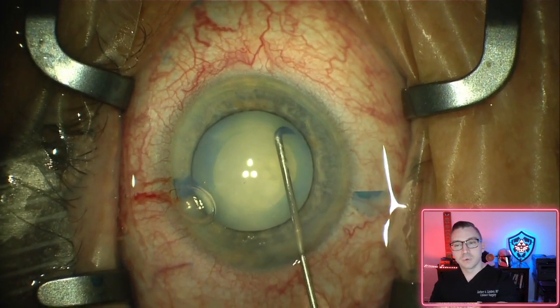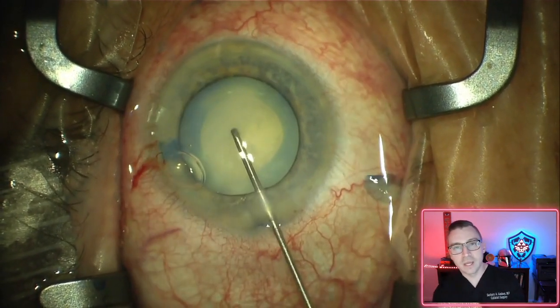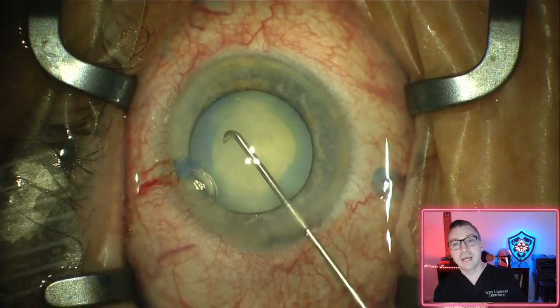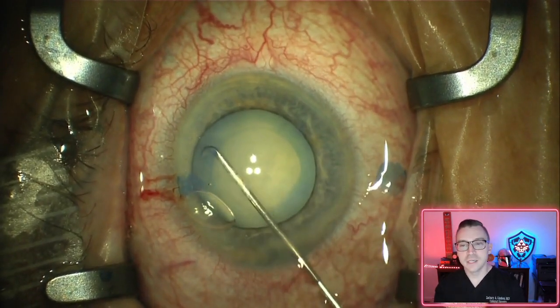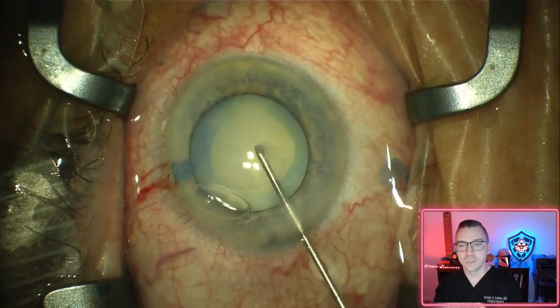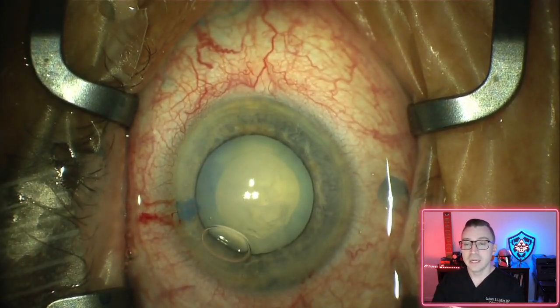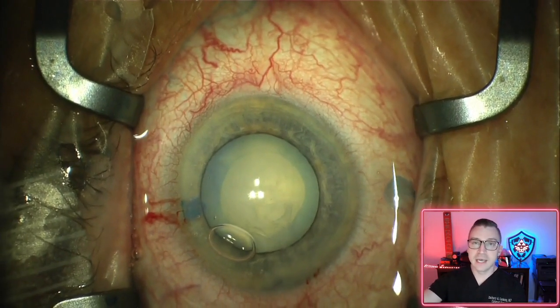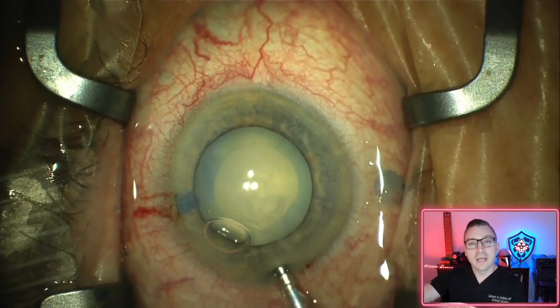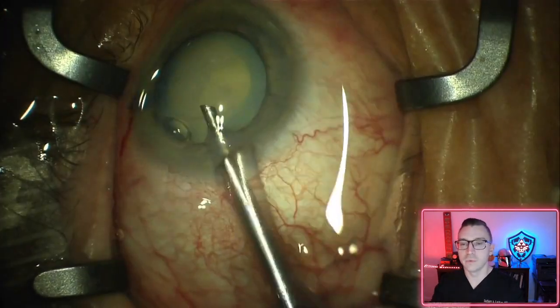If this cataract were not as extreme and we could actually see through it, you would actually see a nice fluid wave go around back behind the cataract. That's how you know you've gotten a nice dissection there of the cataract from the surrounding cortical material. We can't really see that here, so we just kind of have to do it by feel. And then I'll sort of tease the cataract with that cannula to see, do I have a nice spin? Do I have a nice rotation? And we're doing okay there. We had what we wanted.